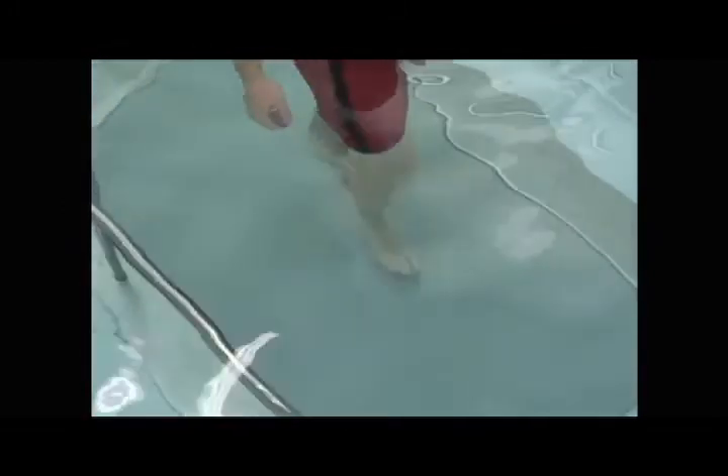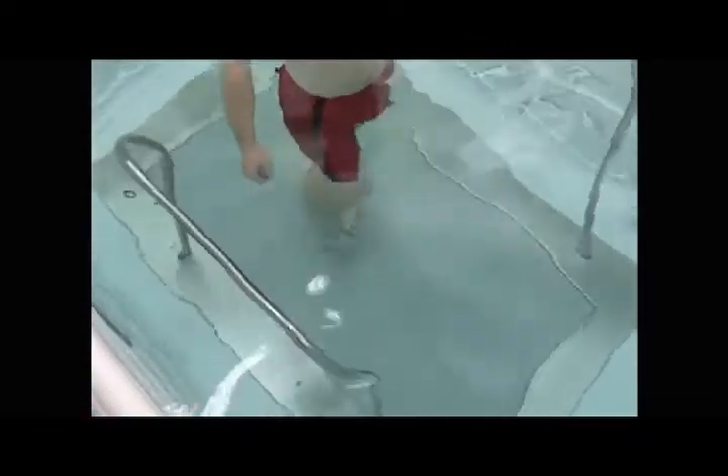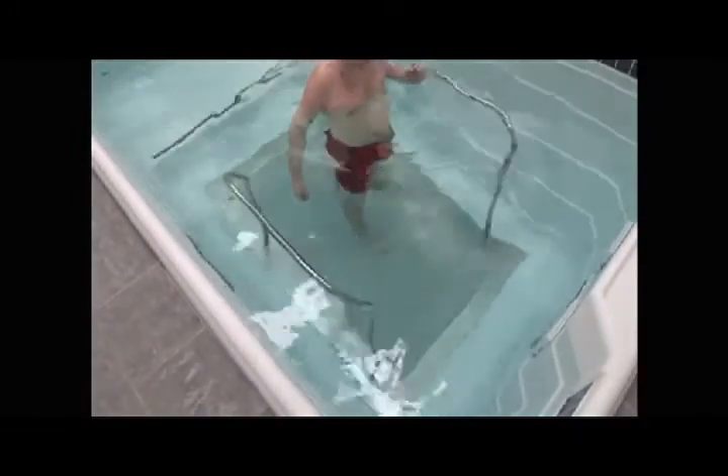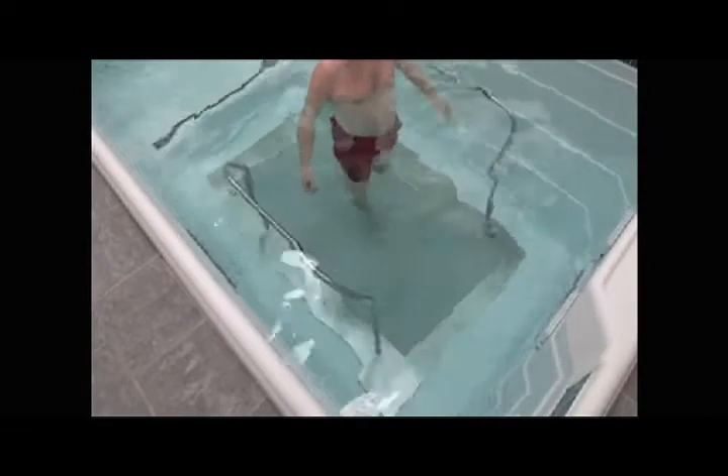The last segment of the walking portion we sped it up to three miles an hour for another two minutes. This was the first day he was in the water, about a week after an ankle arthroscopy. After that we backed it down to one and a half miles an hour and worked on some lateral slides.